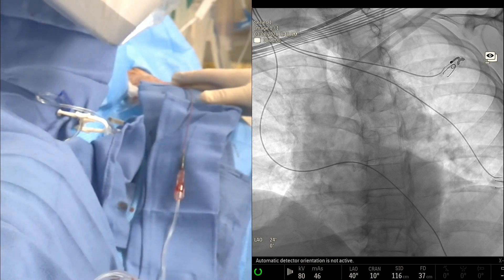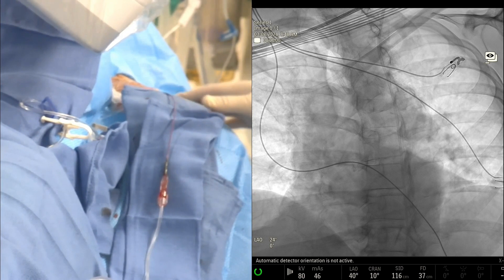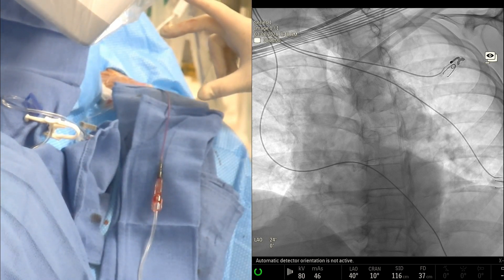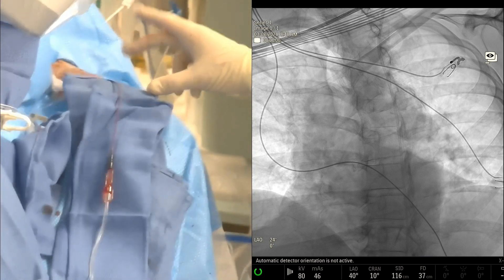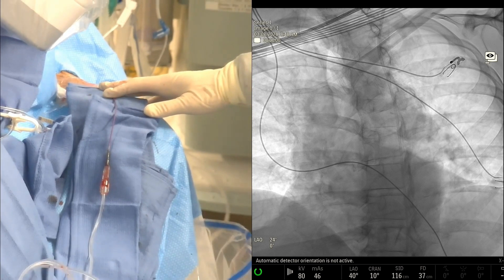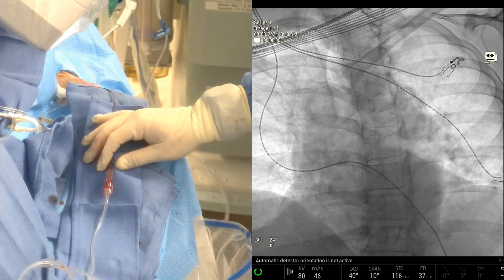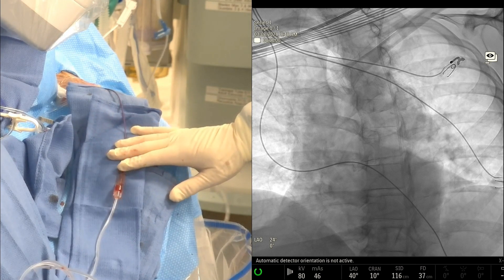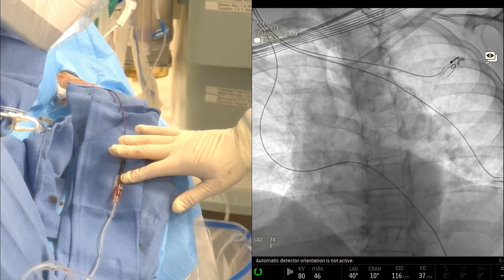This is a five French slender, as Puneet mentioned. We usually access a little bit higher on the wrist, approximately about that much higher than the styloid process, which gives us ample space to be able to get our diagnostic catheter pretty close to the prostate artery. As you'll see in a few minutes, that's one of the key things, in my view, to getting very close and getting a quick cannulation of the prostate artery.